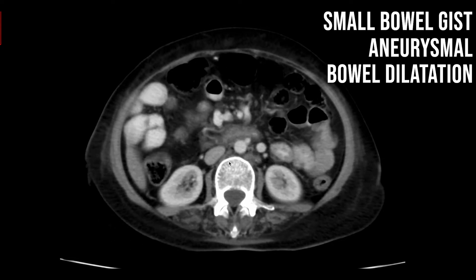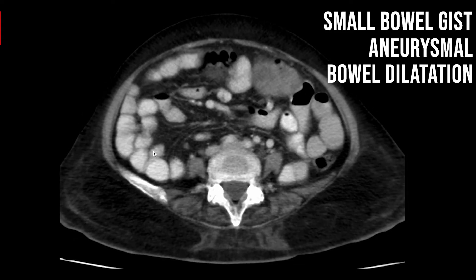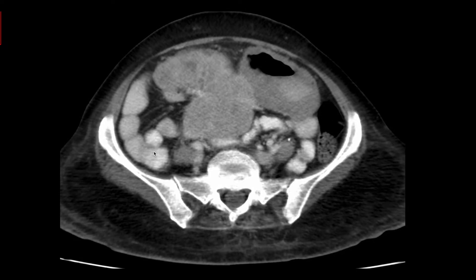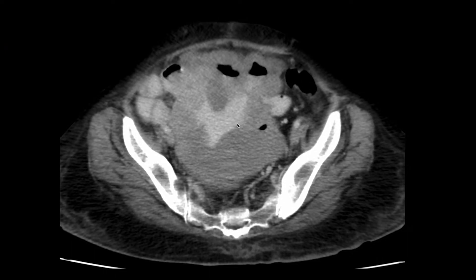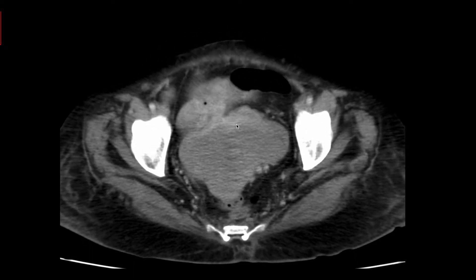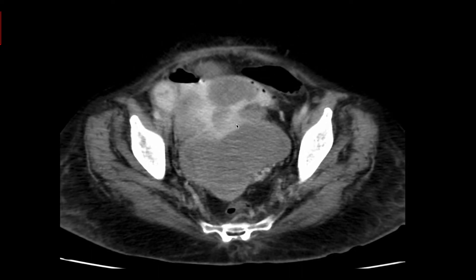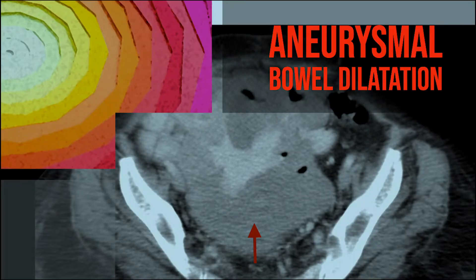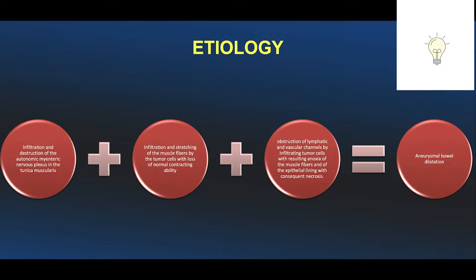The tumor was showing an air-fluid level; the irregular walls are very well appreciated here. Other small bowel loops are normal, and there was normal flow distal to the lesion. The large bowel loops were collapsed. This is a case of gastrointestinal stromal tumor with liver metastasis.